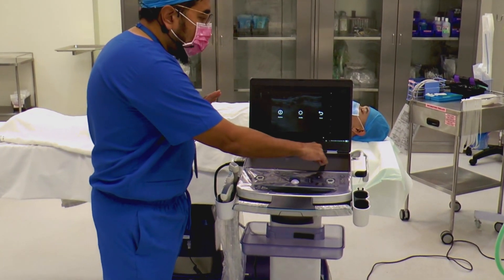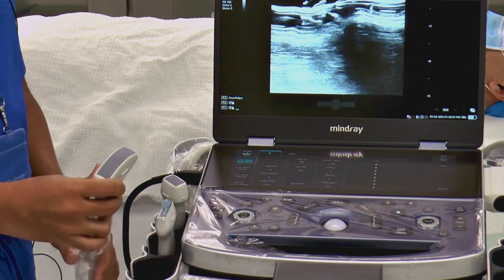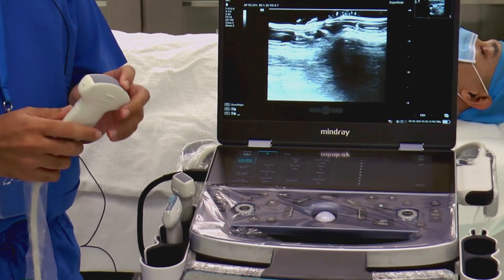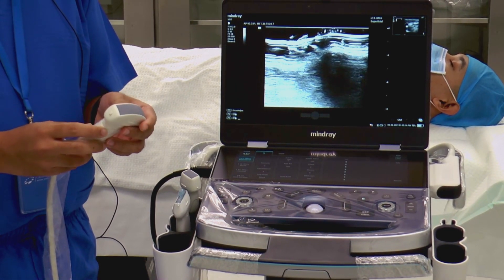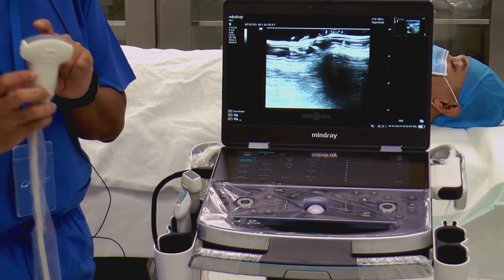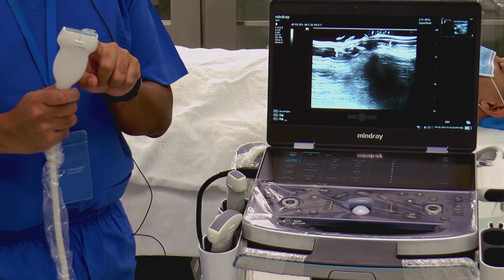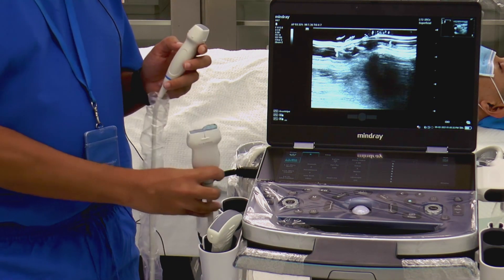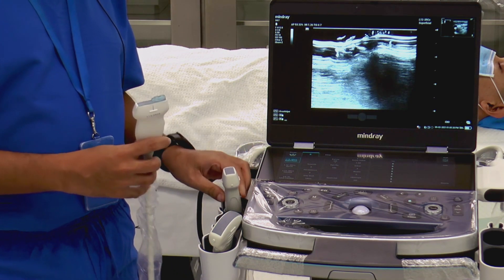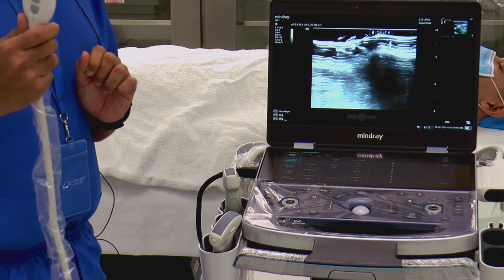We are going to start the system. Before that, let me cover some of the probes that are available. For those who are new to ultrasound, the initial part of the demonstration may not be so relevant to experienced users. We have the curvilinear probe — lower frequency with higher penetration. The linear probe, which we are going to use, has higher frequency, lower penetration, but better resolution. Finally, we have the phased array or echo probe, which we will not use today — it's mainly used for echo examination. For airway, it's linear until proven otherwise.